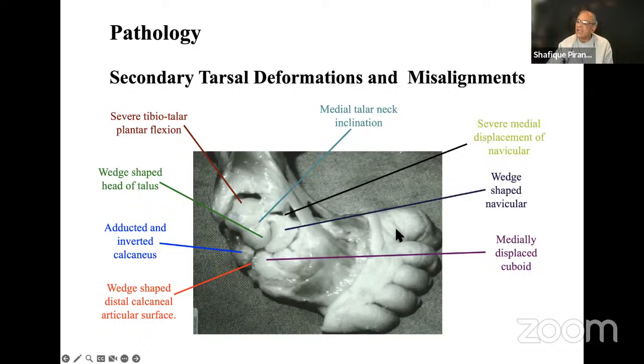And that isn't exaggerating the deformity. It's actually correct. It's unraveling this part of the deformity before you unravel this part of the deformity. It's a very common misunderstanding that supinating the forefoot is aggravating the deformity.